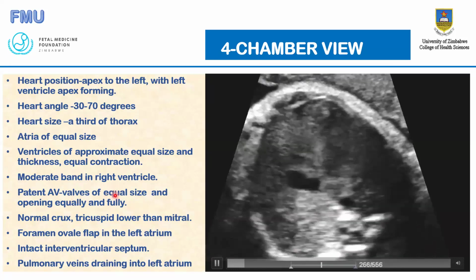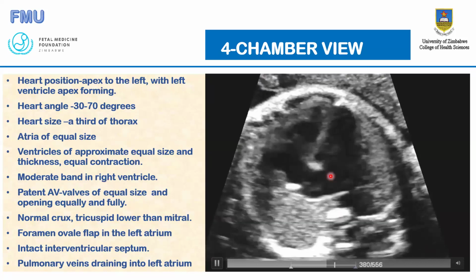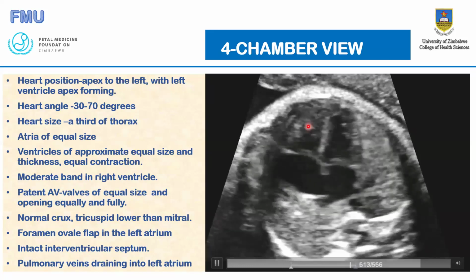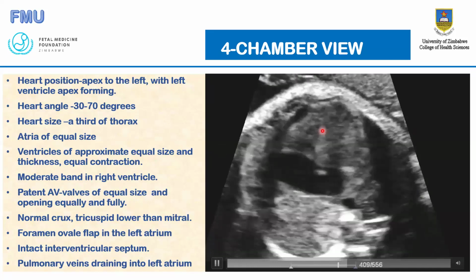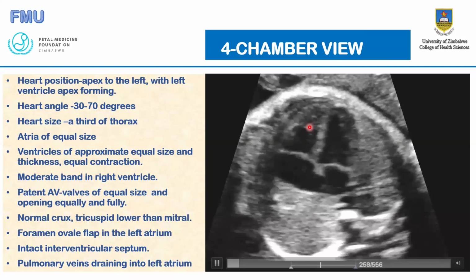Then the moderator band. I've already emphasized the issue of the moderator band in the ventricle. Please look for the moderator band. Don't just look on the right side of the heart and say, oh, this is the right ventricle, without checking the moderator band.